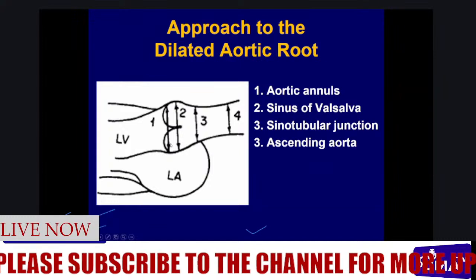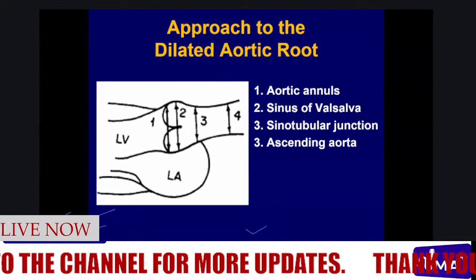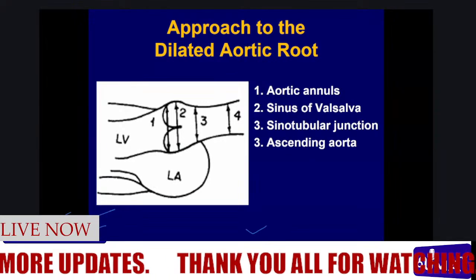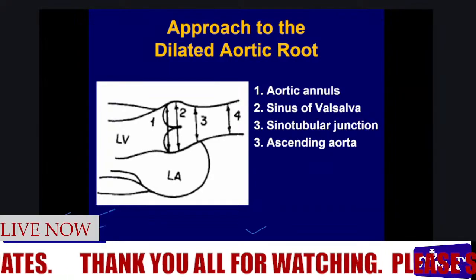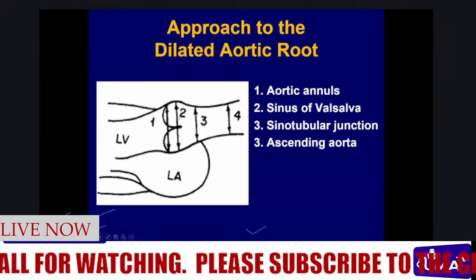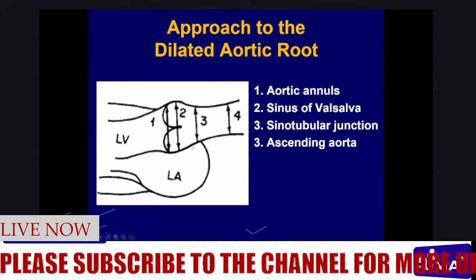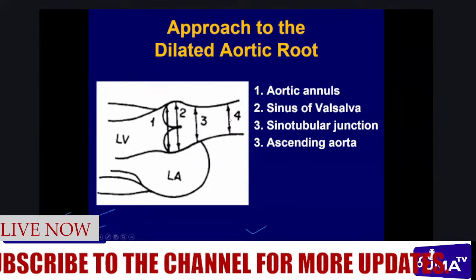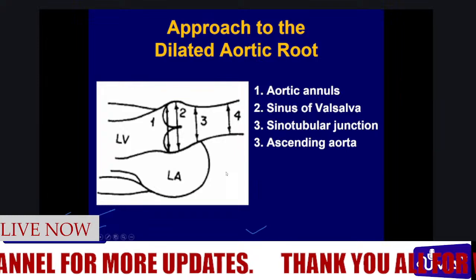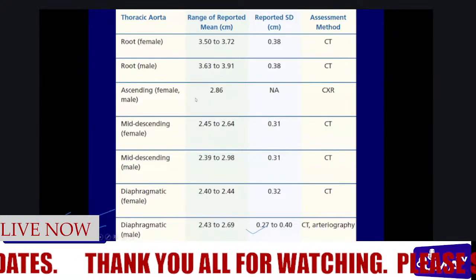It's usually bigger here. So when the radiologist tells you they measured the aortic root and the diameter is maybe 4.5, you have to ask them, where in the aortic root did you take your measurement? Did you take it at the annulus? At the sinus of Valsalva? At the sinotubular junction? Or at the ascending aorta? It's very important to clarify where they took their measurement, because all of them are different.